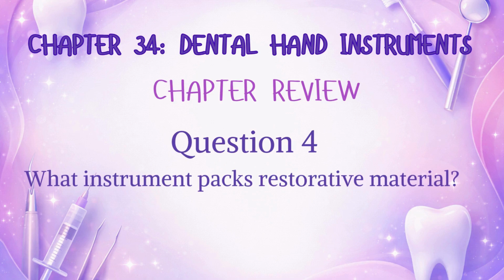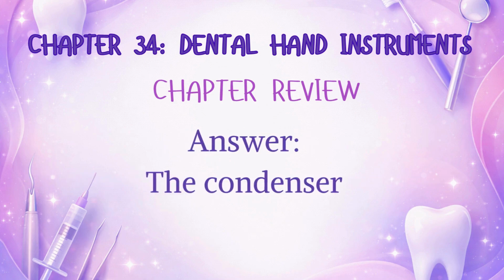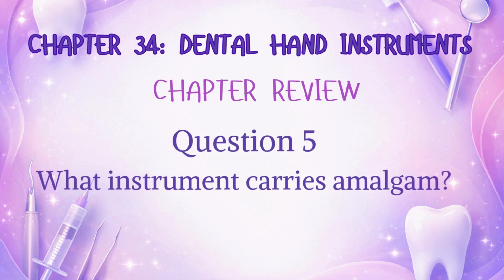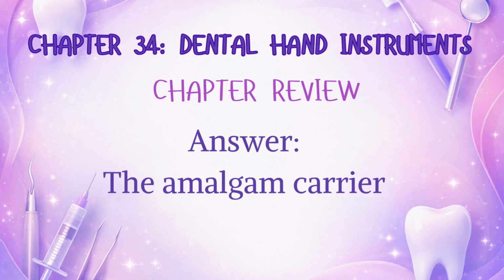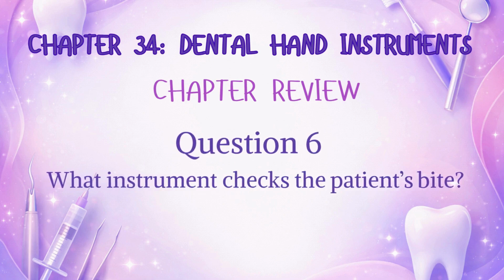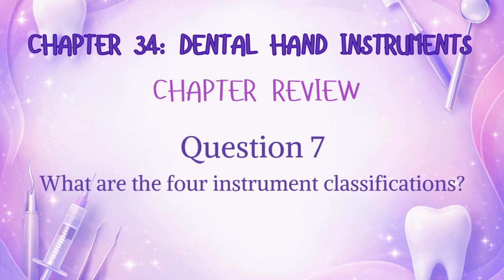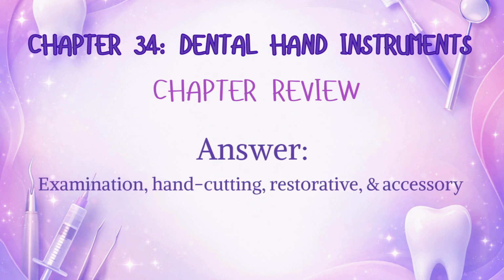Question 4. What instrument packs restorative material? The condenser, correct. Question 5. What instrument carries amalgam? You got it, the amalgam carrier. Question 6. What instrument checks the patient's bite? Absolutely, articulating paper. Question 7. What are the four instrument classifications? Exactly, examination, hand cutting, restorative, and accessory.